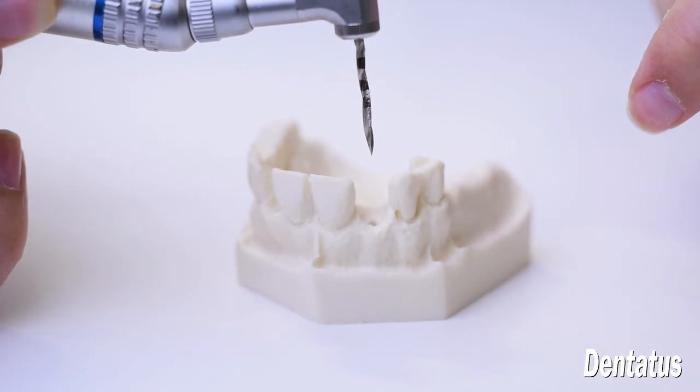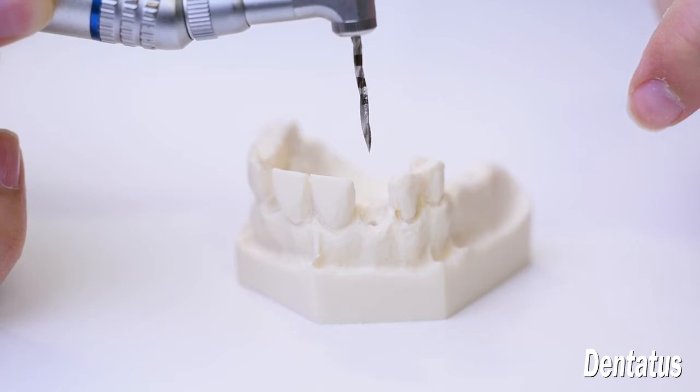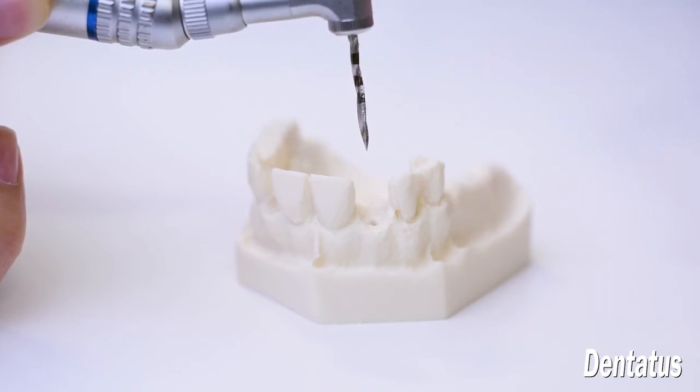In the mandible, Dentatus recommends drilling to full depth. In the maxilla, it's recommended to drill to half depth, evaluate the density, and proceed from there. Then, depending on the implant selection, the corresponding drill is used to further enlarge the osteotomy.